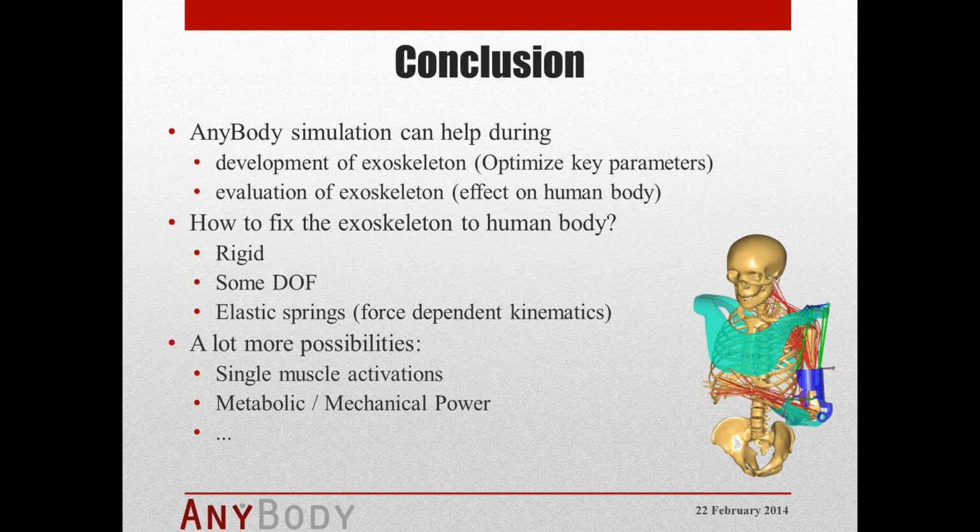what your exoskeleton is actually doing on your human. In our case, it was a healthy subject, but if you have a patient, you can do that as well. How will the patient or the subject be affected by these exoskeletons? In our case, we used a fairly basic way to attach the exoskeleton to the human body.